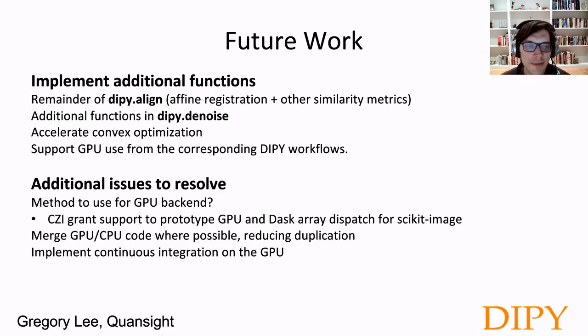Another area we talked about but I haven't had a chance to look at much yet is accelerating some of the convex optimizations that get used in the reconstruction models. And we would like to be able to select to use GPUs in some of the DIPY workflow code.